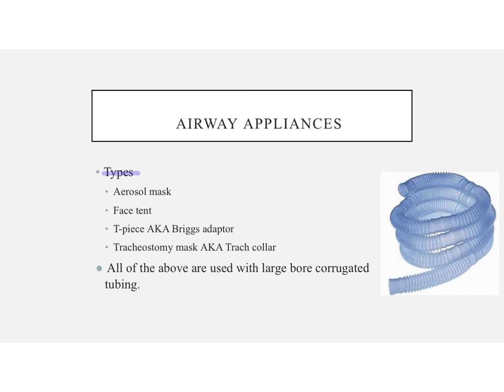Then we have the face tent. This will be used post-extubation and if a patient can't tolerate the aerosol mask. Some patients feel claustrophobic in the aerosol mask, and the face tent is more open, so they tolerate that better.